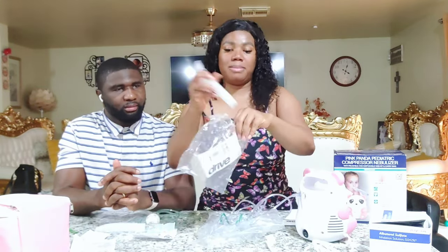If you can disconnect all these ones. So they say these are disposable. Now, the medications. That feels good to sit down. So that's that for the mouthpiece, and now for the medicine itself. I think we had 90 quantities, and we're supposed to give it for 7 days. So all you need to do is to rip this off, and it's easy.